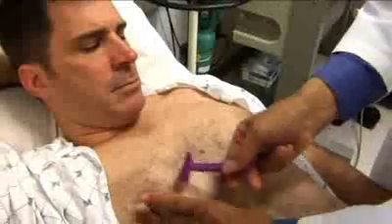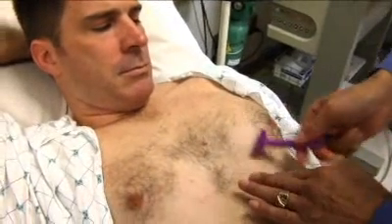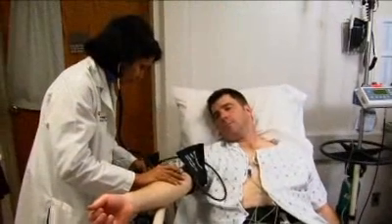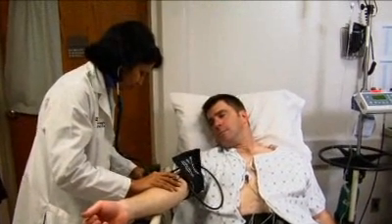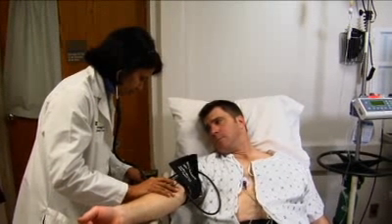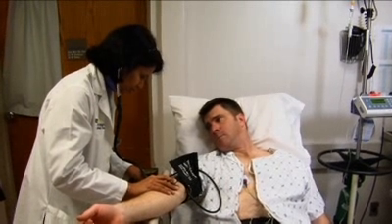In men, limited shaving of the chest may be required to assure good contact between the skin and the electrodes. A blood pressure cuff will be placed on your arm so that your blood pressure can be measured before, during, and after exercise.